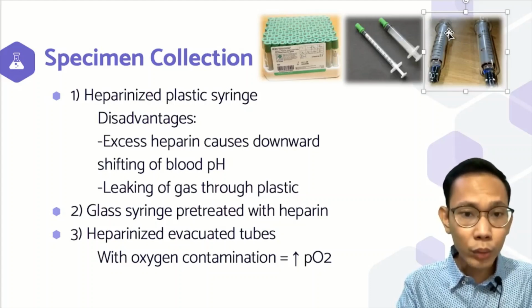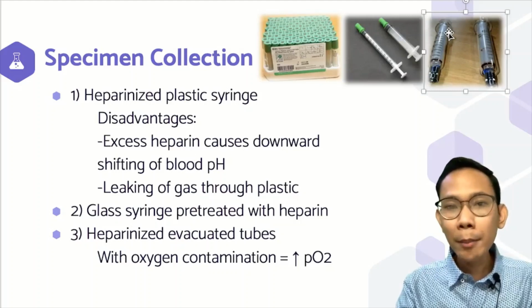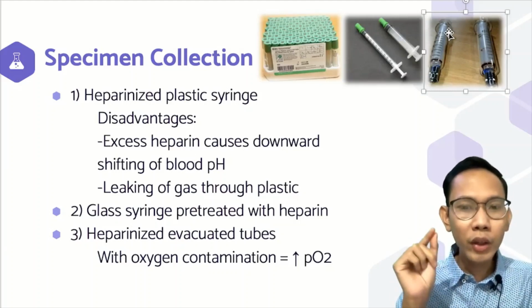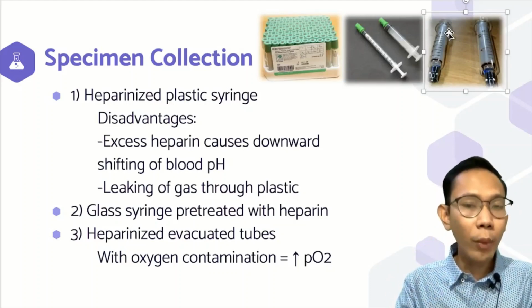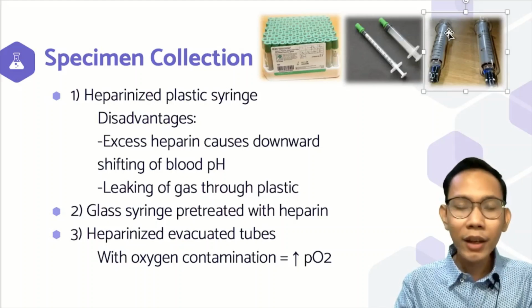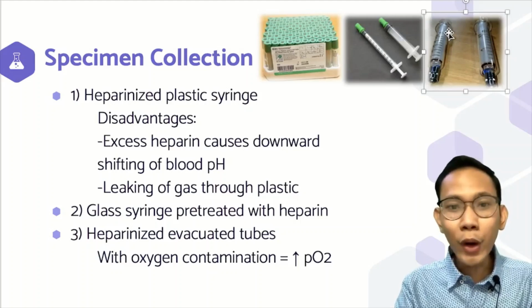Physicians are trained to do so. Remember, arterial blood gas, so your sample must come from your artery. We really puncture the artery, and there will be training for that. And of course, as medical technologists, we are not trained to do arterial collection. Again, as medtechs, we are not trained to do so. However, if you undergo training, why not?